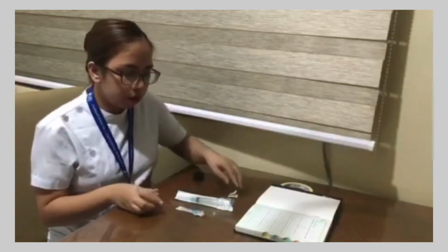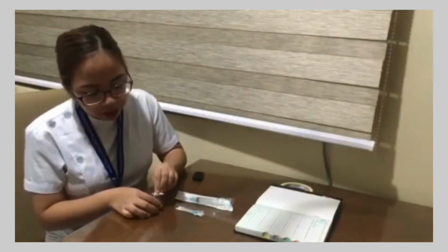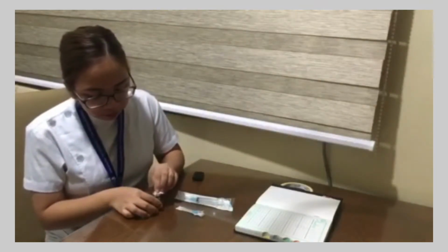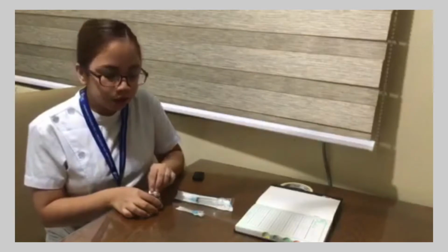Next, I'm going to use the aseptic wipes to clean the rubber area of the vial. This is to reduce the microorganisms and to clean off the dust or dirt.